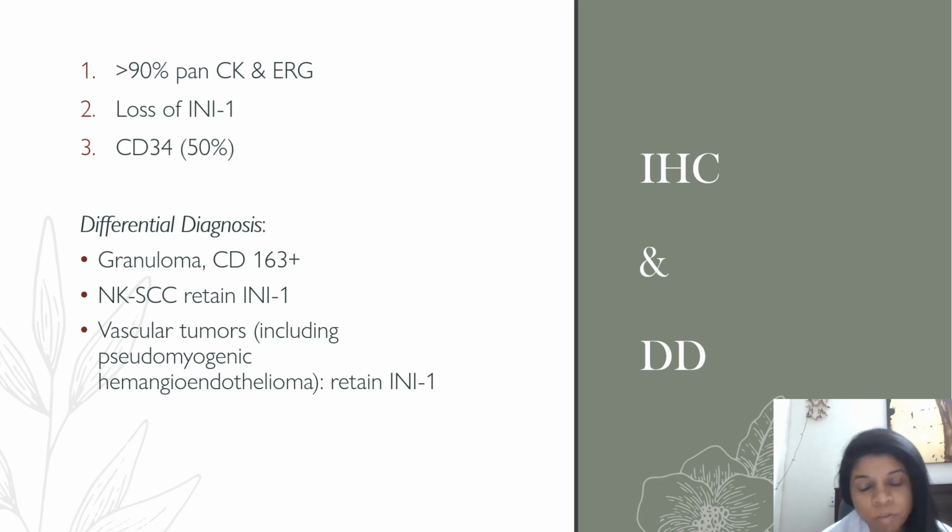As for the morphology, I said they are nests that are surrounded by fibroblasts and spindle cells. So that is a morphology you see in granulomatous lesions.